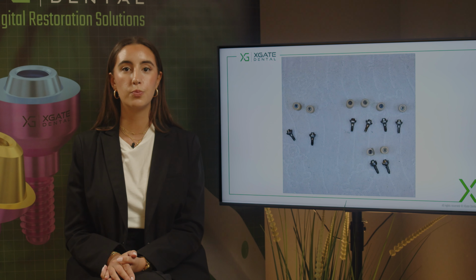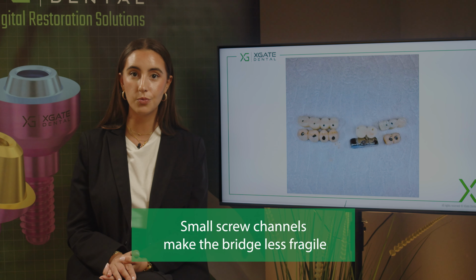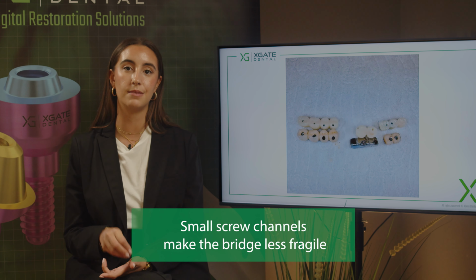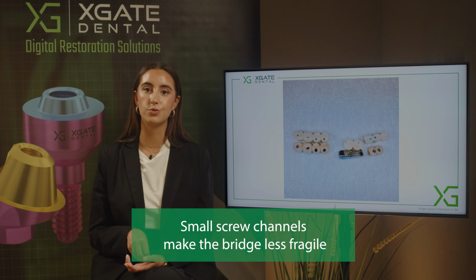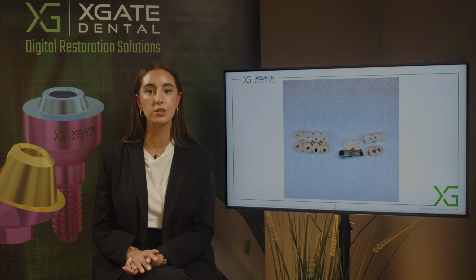Here you can see the new bridge versus the old bridge. First of all, the design of the screw channel and the design of the bridge itself, you can see now with the CAD/CAM, with the material, with the new technology, what is possible to be done. What small screw channels, what delicate work we have versus the pre-CAD/CAM design. Here you can close the screw channel and you don't need to use any angular multi-unit. You can restore just the screw channel and it'll work perfectly fine.